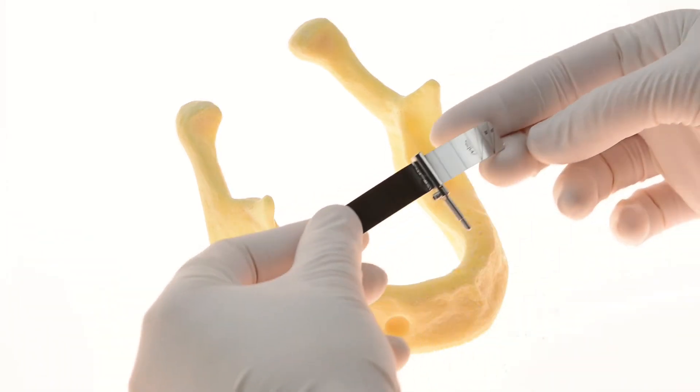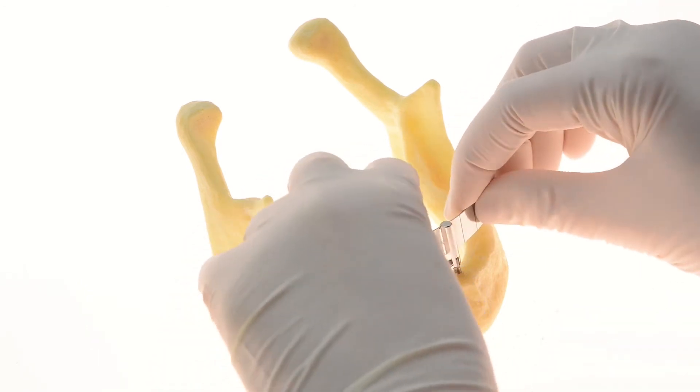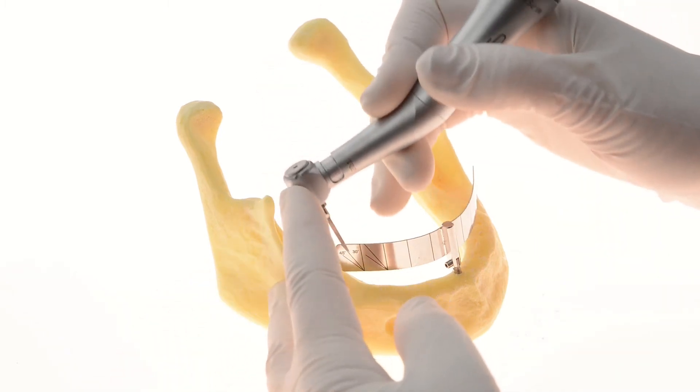The guide strip is provided to help evaluate the drilling angle for the tilted implants in order to ensure a safe procedure. Once the guide strip is in place, angle markings clearly show the correct drilling angle.